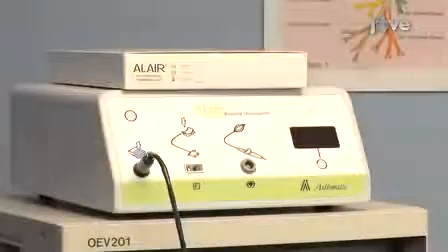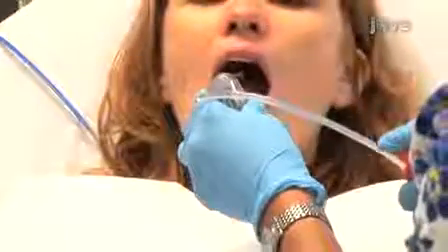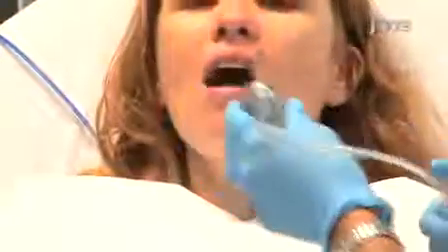A gel-type return electrode is placed on the patient and connected to the Alair RF controller for proper functioning of the Alair system. Once the patient is prepared, the sedation is typically accomplished with IV midazolam and fentanyl. Additionally, judicious application of topical anesthesia such as lidocaine is used during the procedure to control the airway reactivity. The patient's nasal passage, posterior pharynx, vocal cords, and bronchial tree are anesthetized.